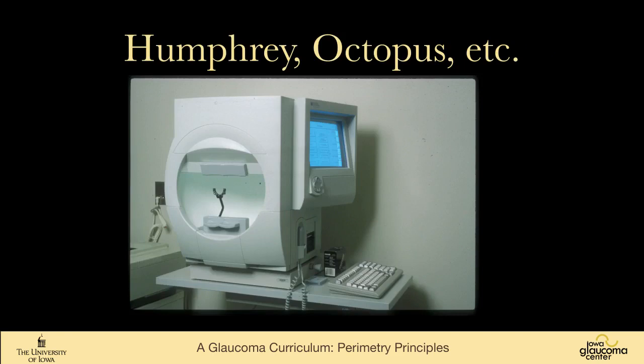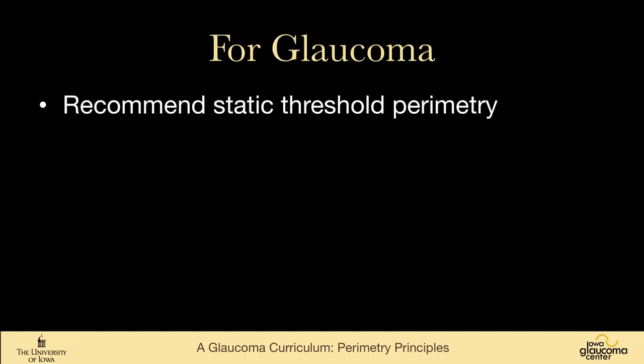So this is a Humphrey perimeter. I think for glaucoma, I would recommend that static threshold perimetry, white on white, is the preferred technique.